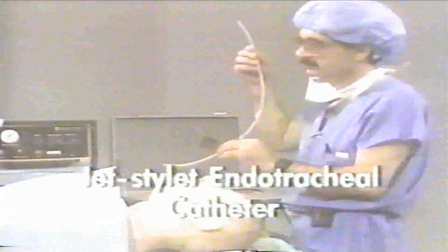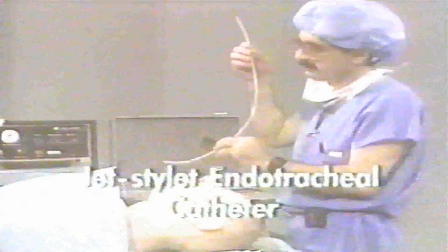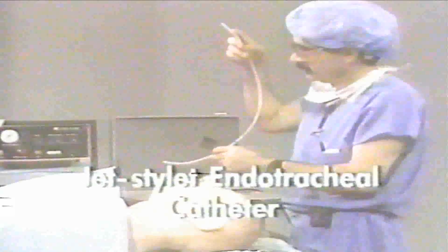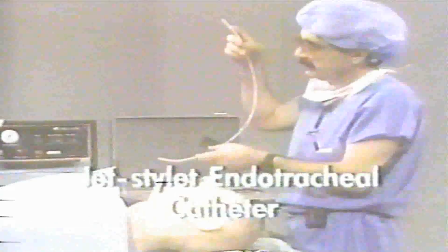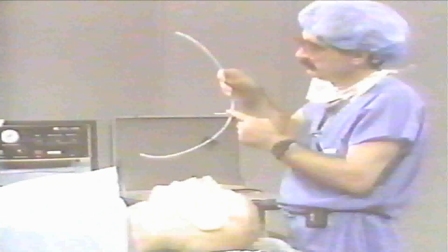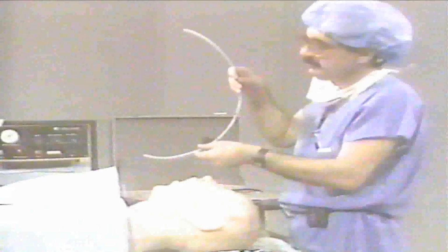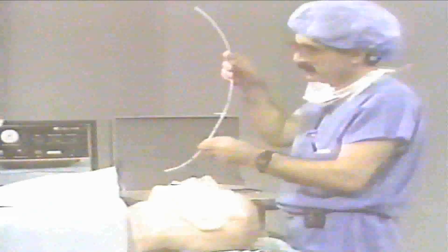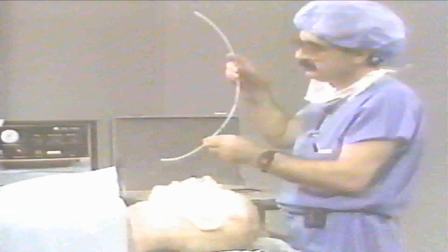Jet stylet endotracheal catheter is a catheter 65 centimeter in length. It has 3 holes at the end. When it's connected to high-frequency jet ventilation, these 3 holes prevent tissue trauma. It has 3 marks, 20, 25, and 30 centimeter marks from the distal end. This is placed inside the trachea, similar to regular endotracheal tubes.